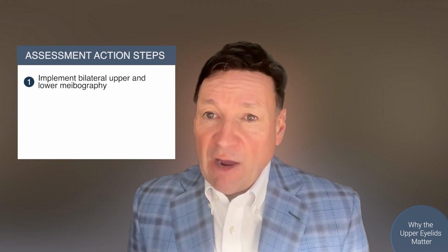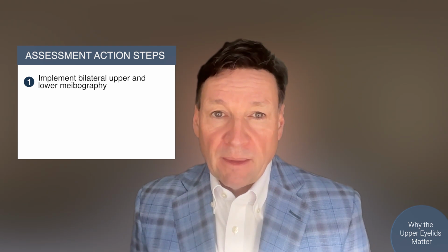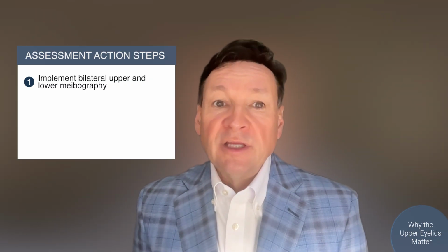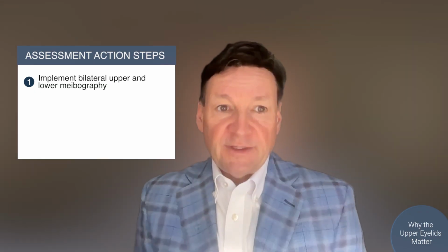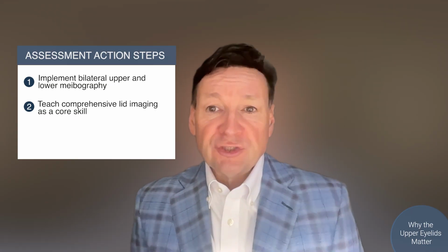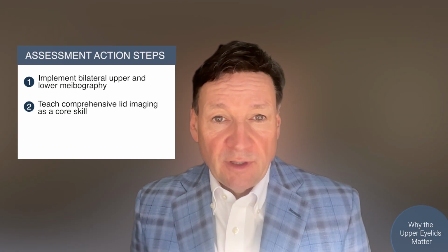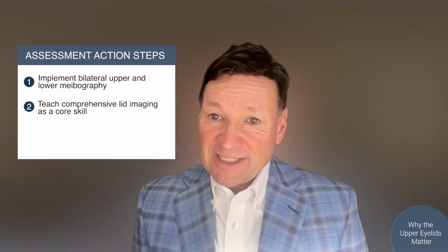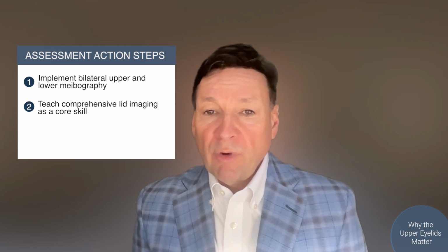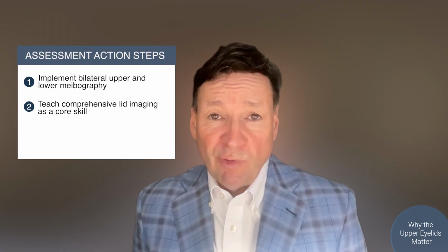Pay close attention to how often the upper lid findings alter your diagnosis or management plan. Many clinicians who make this change are surprised at how frequently upper lid imaging influences their decisions. Second, for your teaching. If you are involved in residency, intern, or fellowship training, make bilateral eyelid eversion and imaging a required skill. The more we normalize upper lid assessment during training, the faster it will become standard. We should reach a point where imaging only the lower lids feels as incomplete as examining only one eye.